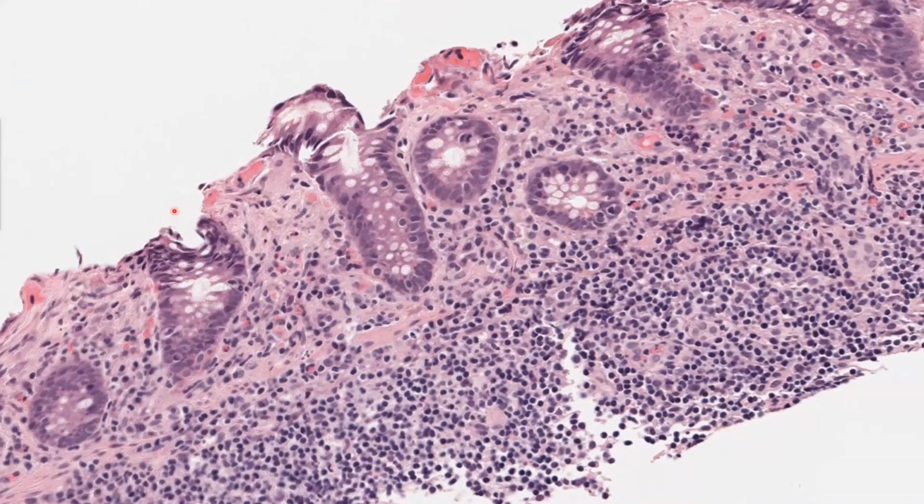And I'm just trying now to highlight where the density of the pink is, is it up or down? It is mainly up. And that is one clue that should make you able to think of what this may represent.